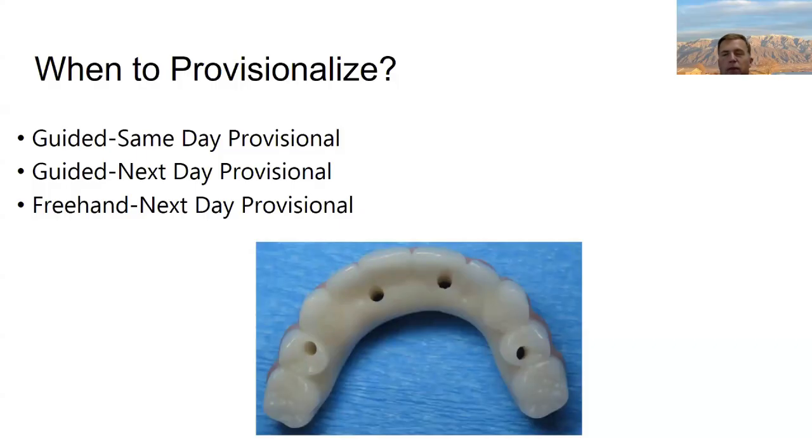Some people think, well, I don't want to deliver the next day, but there are some advantages to that. The first thing is that the person's jaw is in a little better shape, so you can feel more confident if you're doing occlusal equilibration. Generally, if you're doing that on the day of surgery, you've got to kind of just rough it in because the patient's going to settle in a little bit once they recover from having their mouth open for a couple hours. And then the second thing is that they're not loopy, so they can appreciate it. And it's a great time to get videos and testimonials and all that stuff.